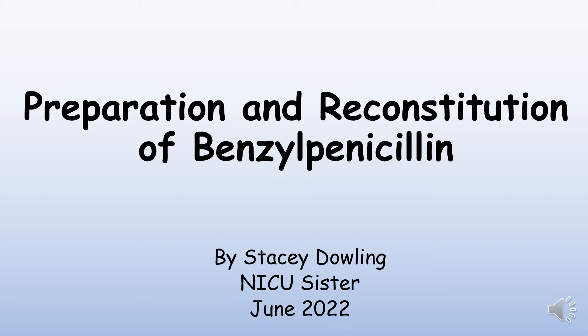In this video I'll be showing you how to prepare and reconstitute IV benzyl penicillin for use in neonates.